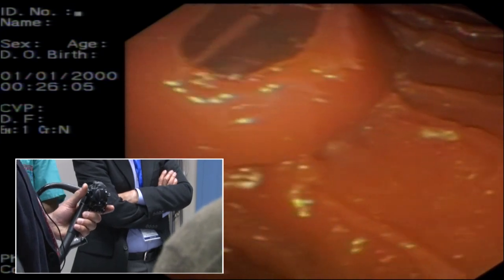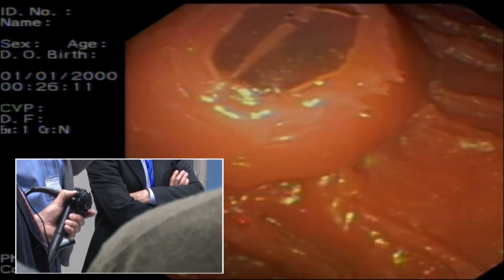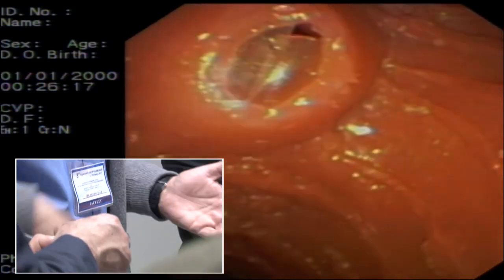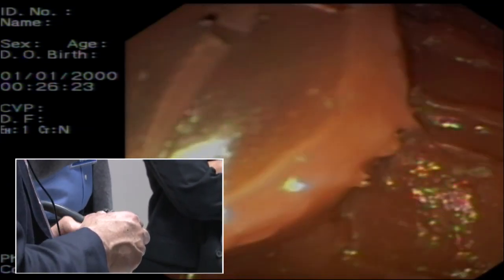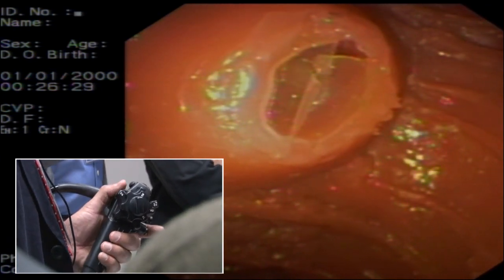So if you look at it, there are three ways of bringing the scope close to you. You can go towards it. This is the standard thing: the big wheel brings it close. When you're putting in your stents, and we'll discuss this, I think that is a very, very useful maneuver. I try and use less of the elevator. You have a single scope.